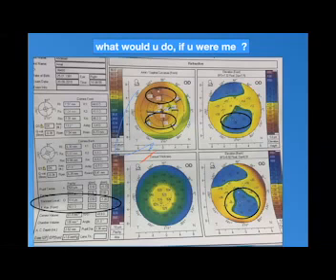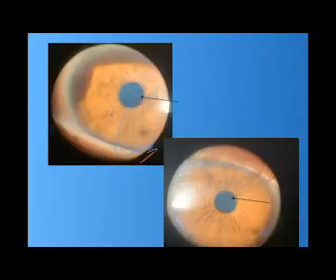So up till now, it's an irregular cornea, but not a keratoconic cornea. So I will go for refractive surgery, as Dr. Mahmoud said. But to skip the problems of PRK with the hyperopia, I will create a flap, because this is the image of the patient. This is the slit lamp photo captured for the patient.